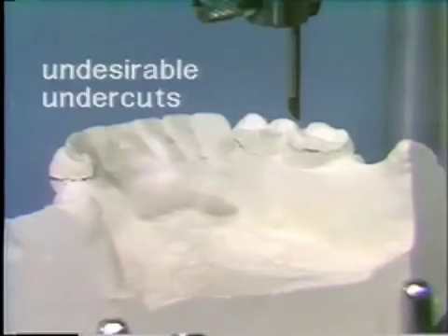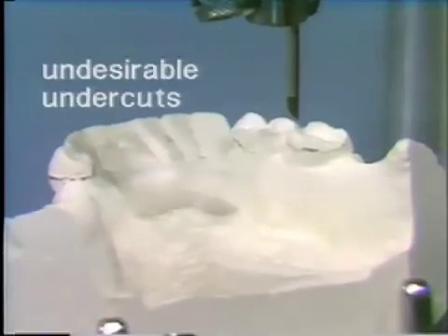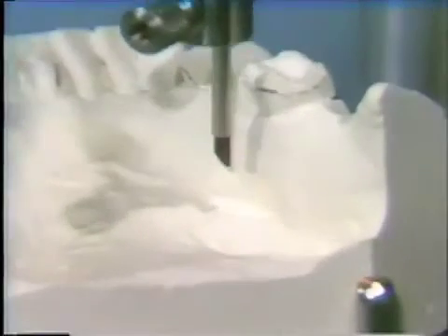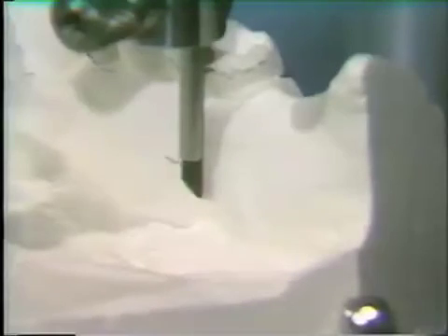The next use of the surveyor would be the location and delineation of undesirable tissue undercuts. We have the carbon marker protected by the shield in the surveyor and the cast locked on the cast holder. We place the carbon marker against the cast and draw the line, which shows an undesirable tissue undercut in the area where we will probably put part of the major connector. We can see that we have determined the path of insertion and removal by locating retentive undercut on abutment teeth, the location and determination of potential guide planes, and the location and delineation of undesirable tissue undercuts.